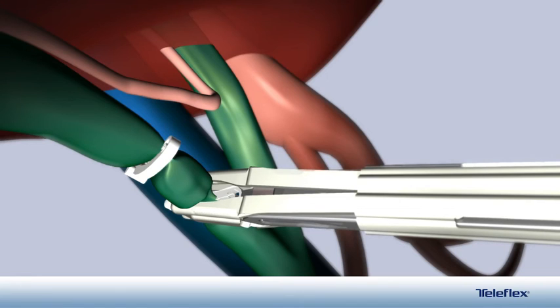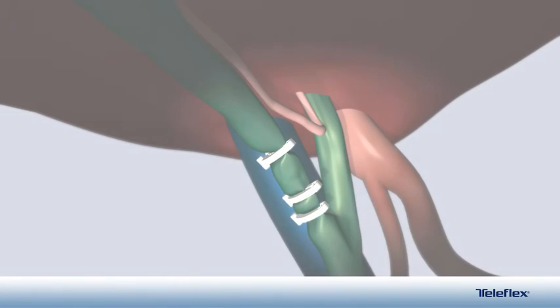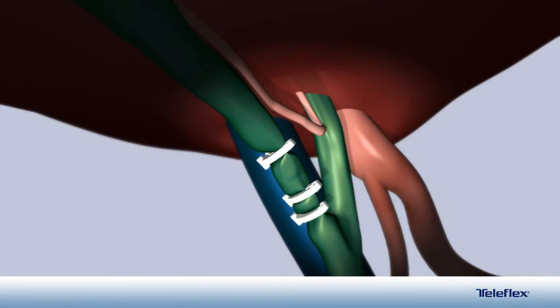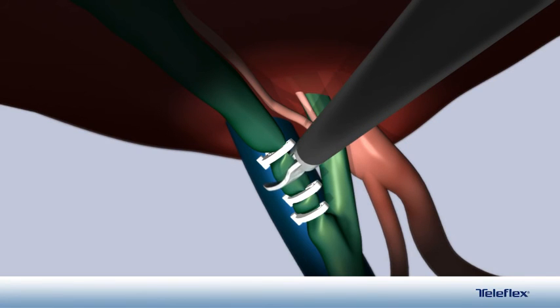Two additional clips are placed across the cystic duct. With three clips placed across the cystic duct, two on the patient side and one on the specimen side, the cystic duct is divided using a pilling laparoscopic scissor.